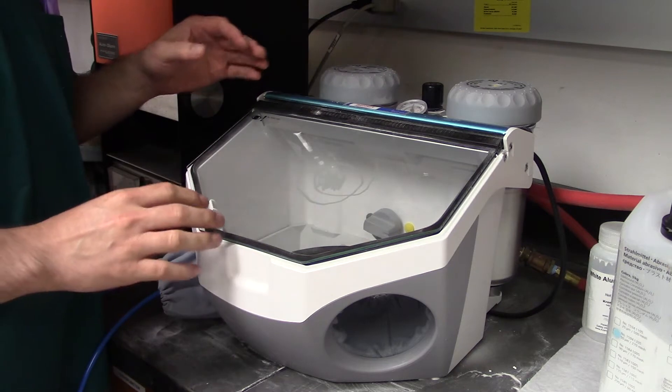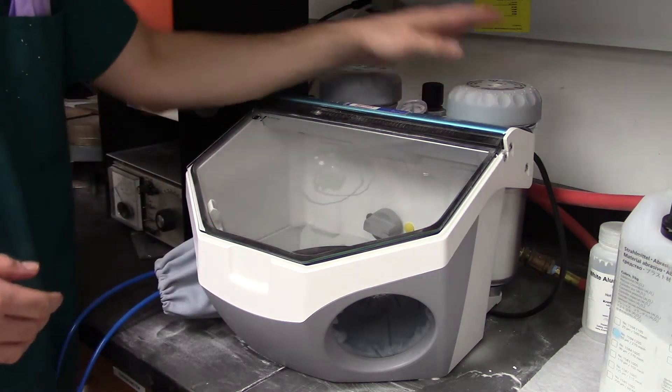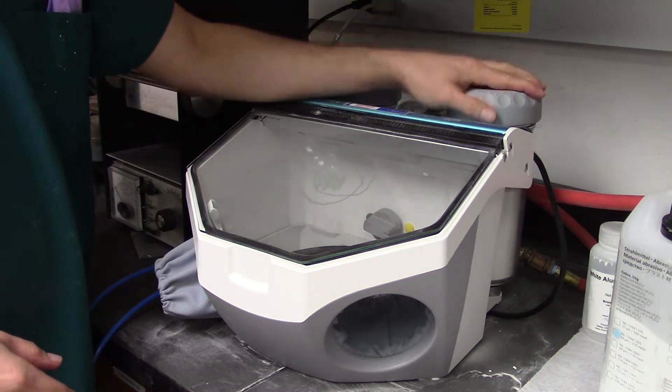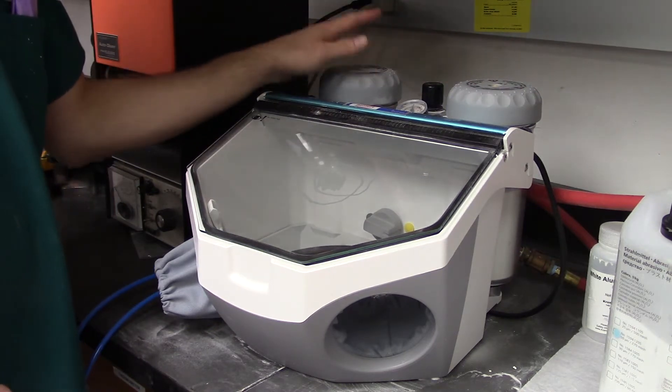There's two different types of sandblasting beads that we can use in these containers back here. So the yellow one on the top, you can't see it, but it says GL, and that means it's for glass beads. And the green one is for alumina particles.